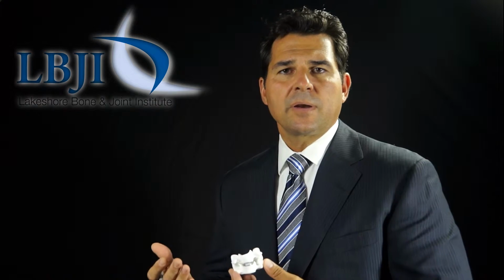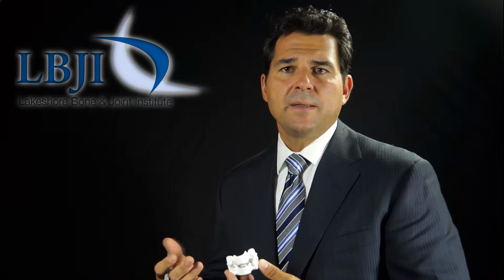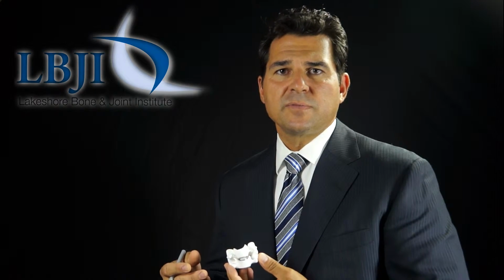The indication for an artificial disc replacement is typically in a younger patient that doesn't have a lot of underlying arthritis or neck pain. This typically is for patients that have isolated neurogenic or radicular pain, usually secondary to a disc herniation of the cervical spine. And usually this is limited to 1 or 2 levels of pathology of the cervical spine.